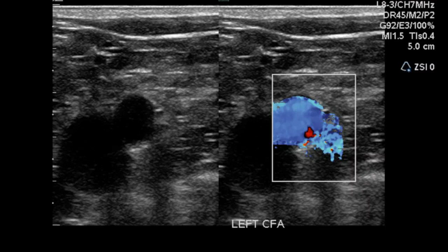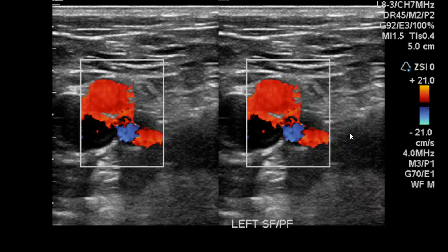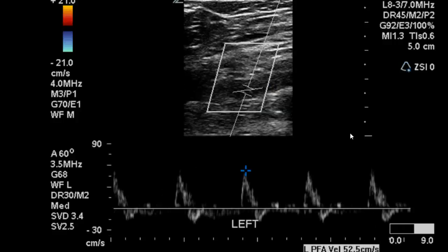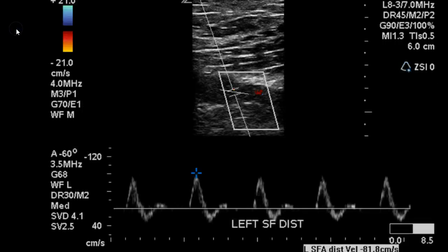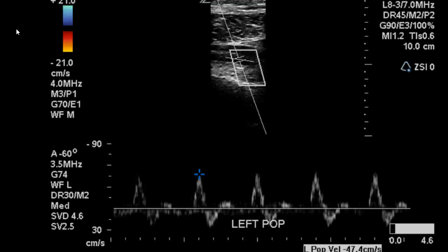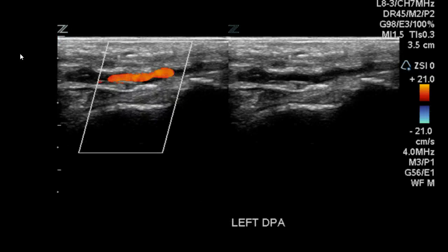Next we move to the left side — the same process continues. You can see here it is possible that the sonographer either took the image at the wrong part of the cardiac cycle or they forgot to invert the color. Either way, you can see that the color completely fills the common femoral. There is the image of the superficial femoral and the profunda femoral, and again moving segmentally down the leg to determine if there are any areas of stenosis, continuing on to the ankle.